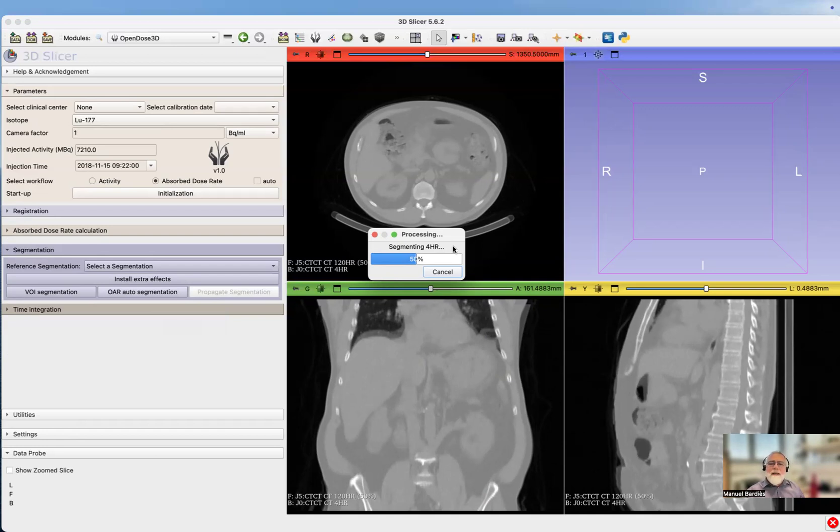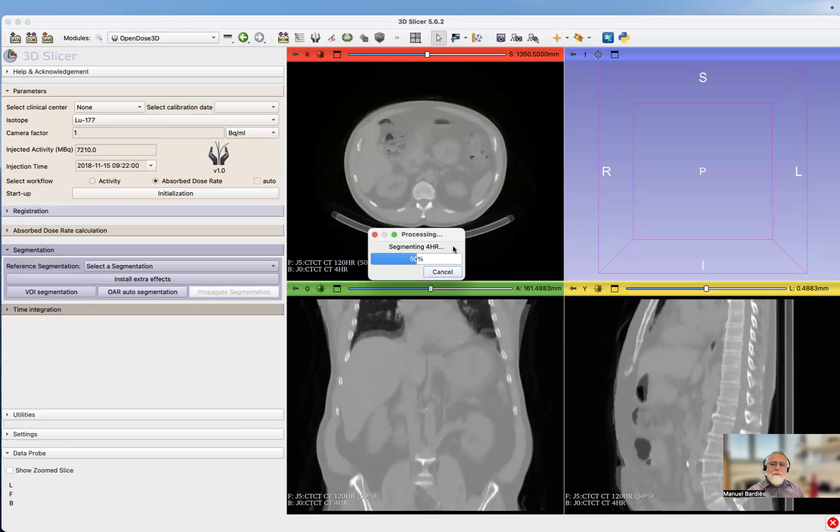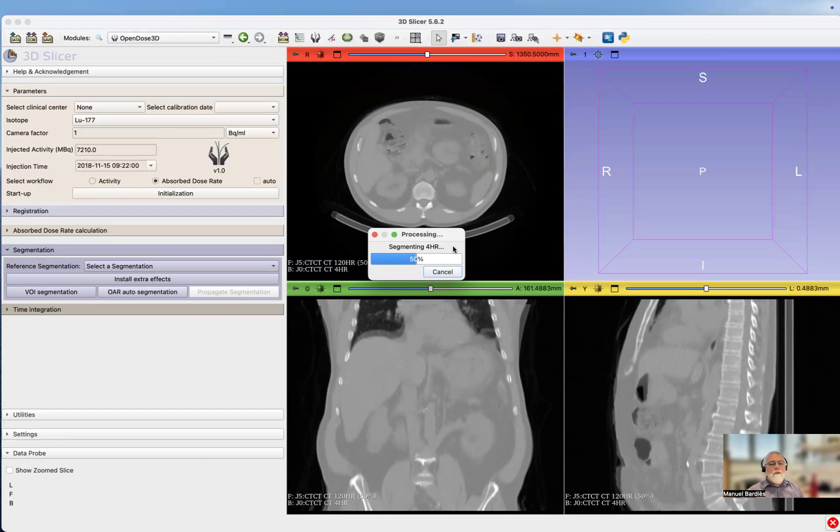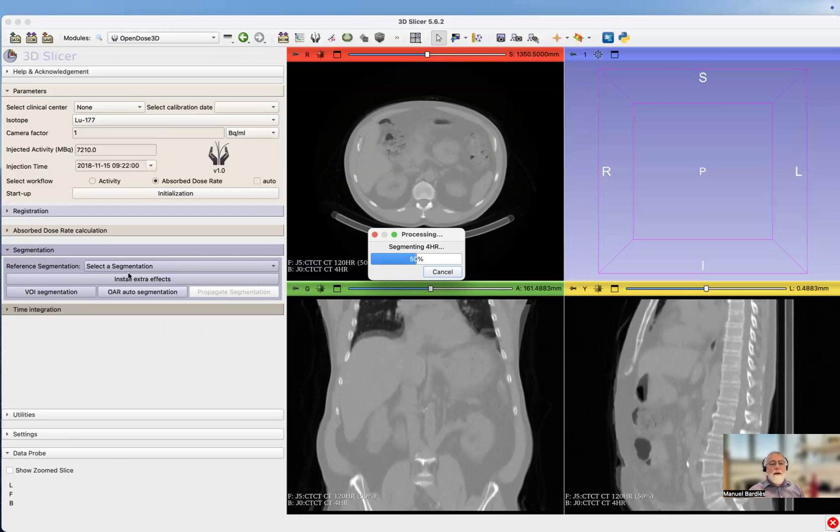This preset list of volume of interest can be defined for every radiopharmaceutical. We'll see later how to do that. It's interesting because you just click a button and thanks to Total Segmentator, you're going to have your segmented volumes automatically on the reference image. It takes a while, but it's not so long compared to the work it is doing.